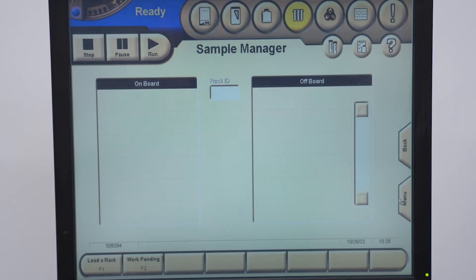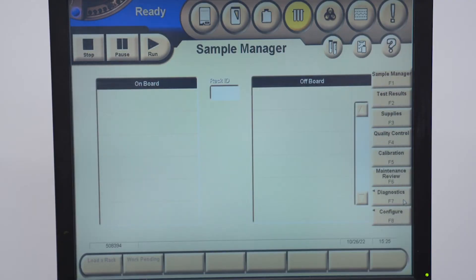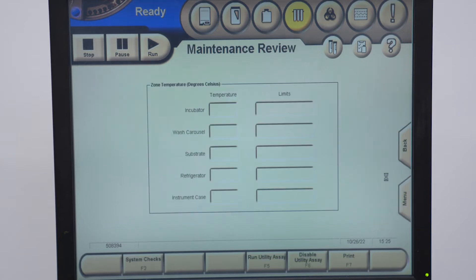The first thing you want to do when you do your maintenance is click on the menu and click Maintenance Review right here. You want to make sure everything is in range — your incubator, wash carousel — these are the limits, and as long as these numbers are within these limits, you're good.